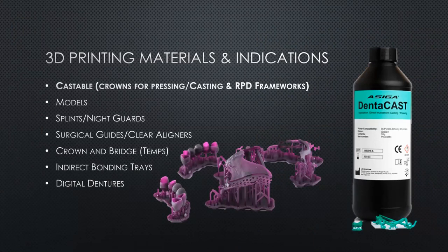If you're milling wax, especially in those sharp incisal edges, you need to put in bur compensation. So printing, especially for things like veneers where you need better fits, is definitely an excellent option.